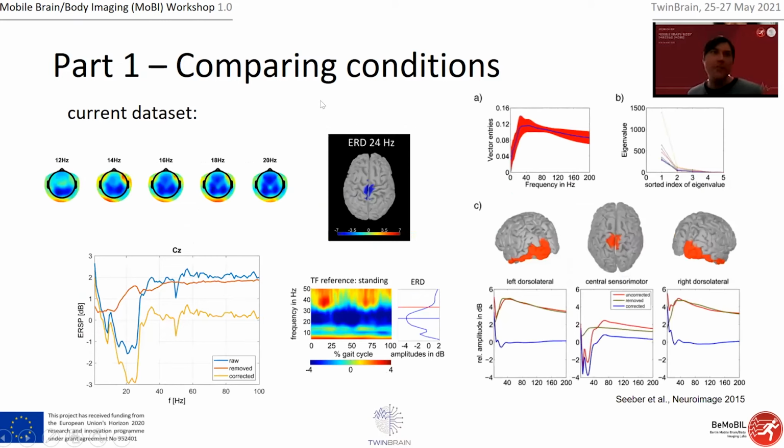To set that into context, this is the current data set where I show beta suppression over central areas. That quite matches the previous results showing central sensorimotor beta suppression, meaning this spectral shape, especially the suppression here at 20, should match the suppression at 20 I showed in my Frontiers paper, plus the spectral shape I showed in the data set from my PhD.